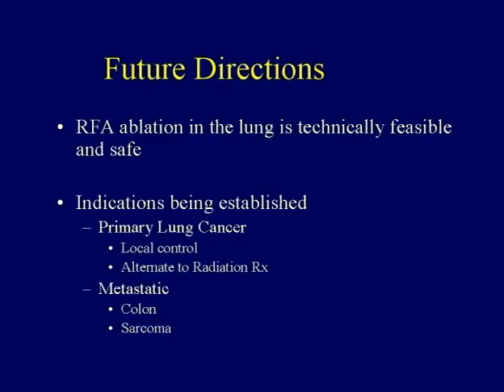Having said that, RF ablation, certainly in our experience, is technically feasible. The patients, in fact, do remarkably well. We have now a cohort of 78 patients that we've treated over the last 4 years. We have follow-up ranging now up to 3 to 4 years. The real issue is, who are we going to apply RF ablation to?